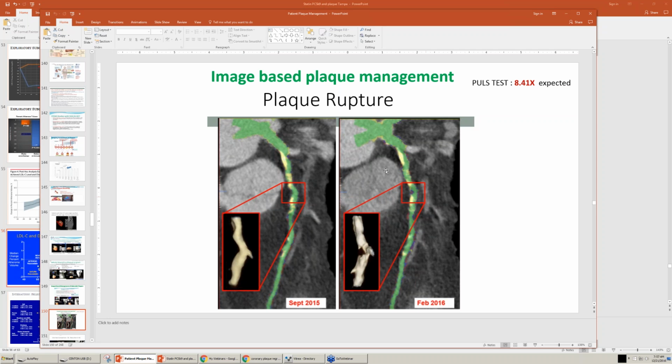And so we did survey his plaque, and his plaque of interest was actually down here. But since he has plaque diffusely, as opposed to the other people I just showed you, we surveyed his entire LAD, and we did a CTA of all of his coronaries, and then we compared them millimeter by millimeter, and you can see we lined them up pretty much. They look pretty close to one another the way we've lined them up, and you can see calcific plaques as fiducial markers. That's a word they use. Fiducial is a boundary word that's used by engineers. I thought of fiduciary having something to do with money, but it's fiducial, and they use that to basically show the markers. And so these are the markers, and you can see they're very similar.